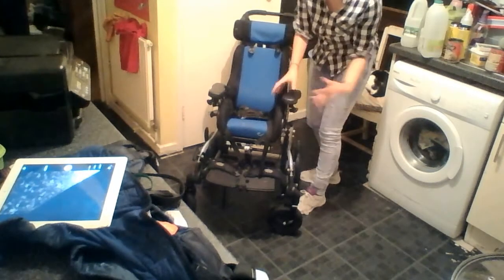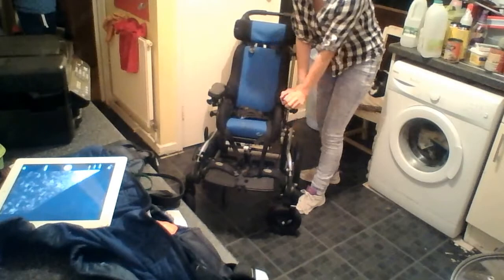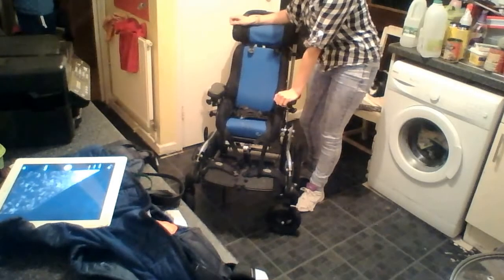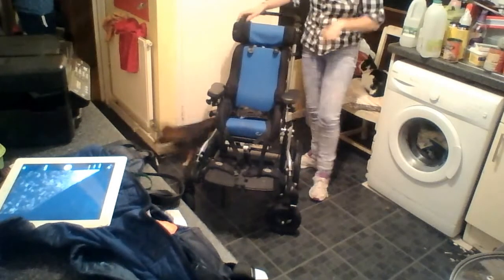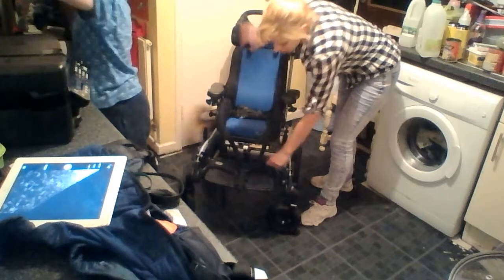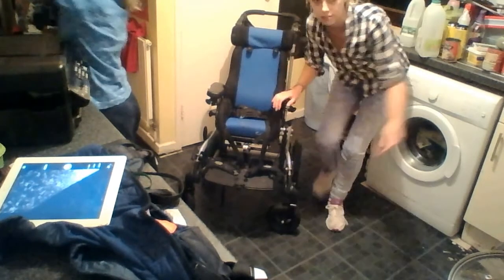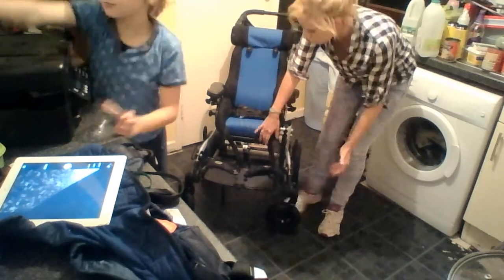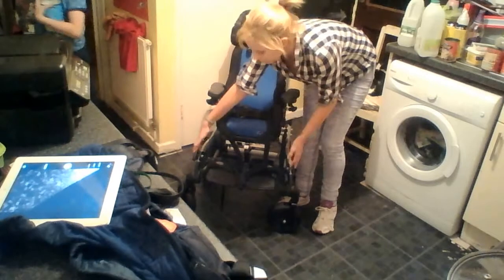The armrests come off if you don't want them on, or you can adjust them. It comes in four different colours — I think green, grey, pink, blue, and orange. The footrest goes up and down. It has got strap things here which Ben has because he extends his feet a lot — it keeps them nice and straight. These come as standard. And these are the hooks that go into your car or bus or whatever.